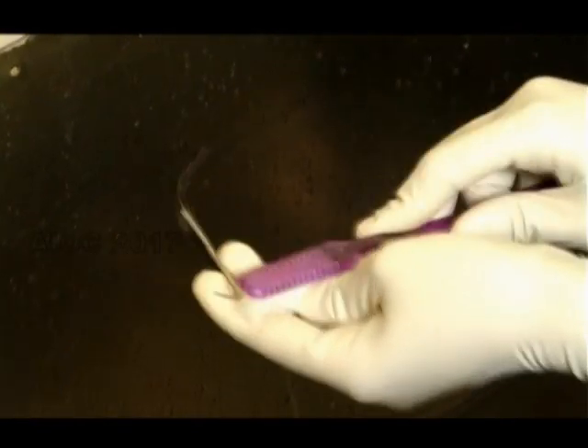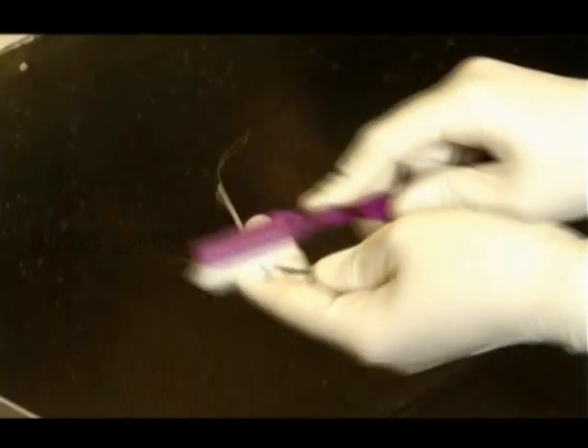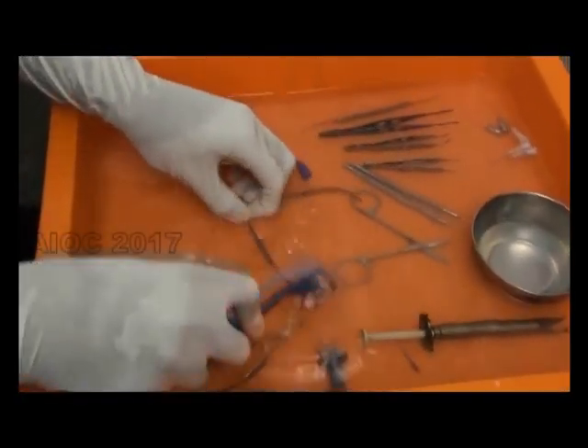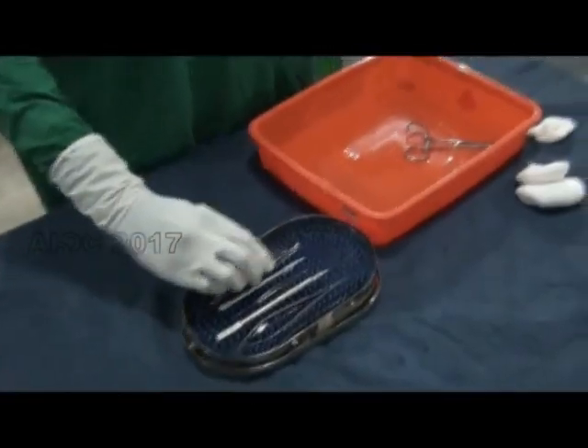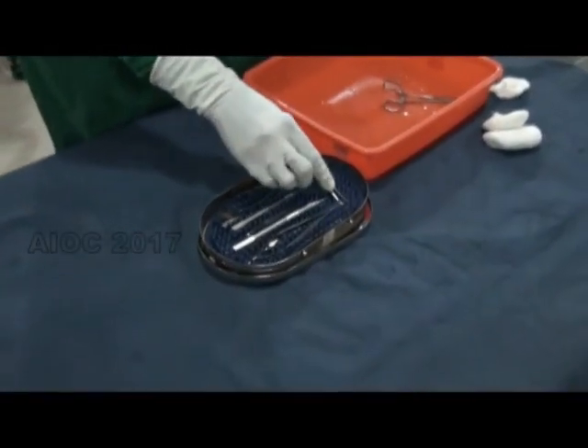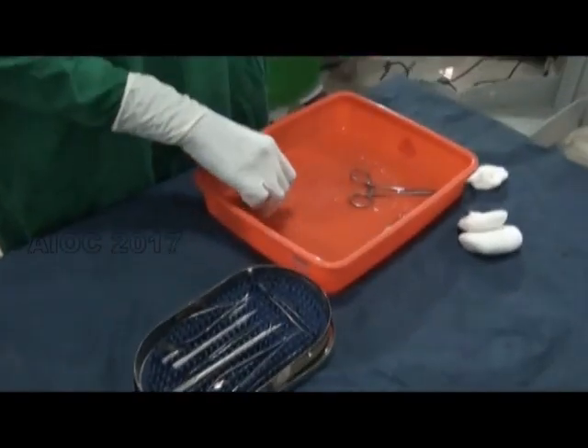While cleaning the instruments, make sure you don't produce aerosol as demonstrated — it has to be cleaned underneath the water. Instruments should never be packed wet; they have to be dried before being sent for autoclave.